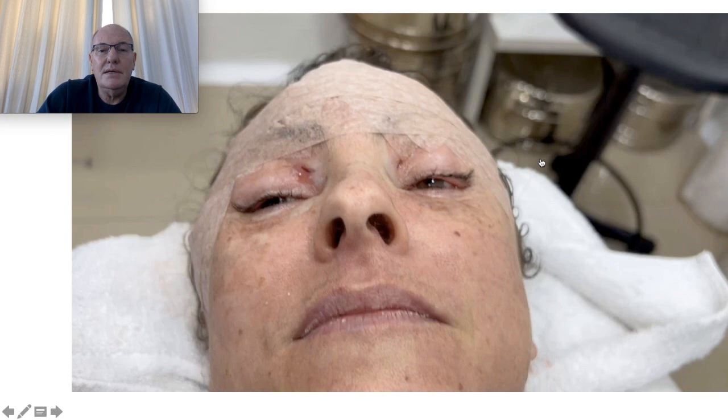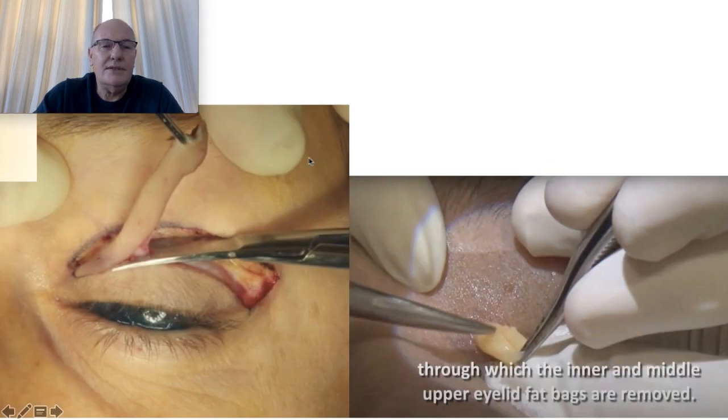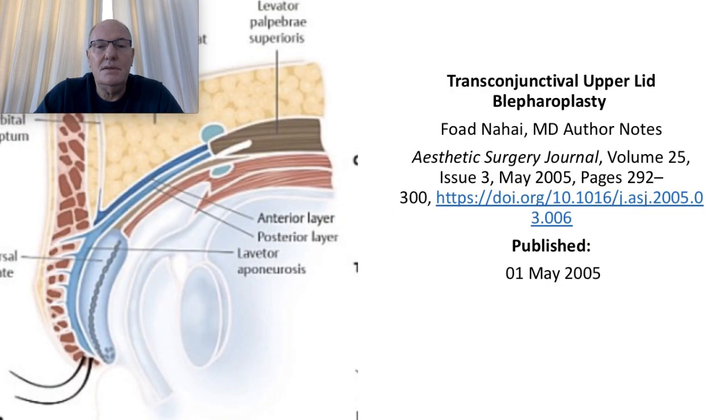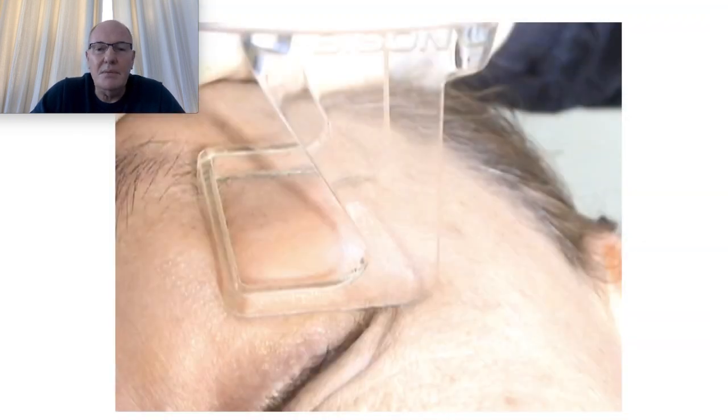This is the patient in the operating room. This procedure takes only 30 to 40 minutes. This is 24 hours, and I change this for this. I tighten the skin. Here is a patient with upper eyelid fat pad, lower eyelid fat pad, and this patient has not a severe photoaging in the skin. In this patient I'm going to use lower energy of carbon dioxide laser. Then the recovery of this patient must be very, very fast.